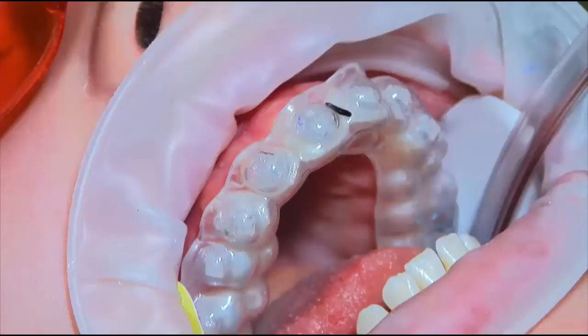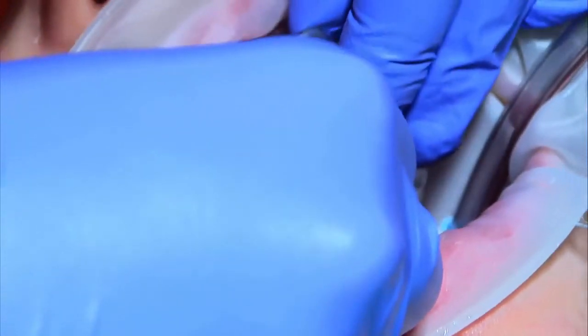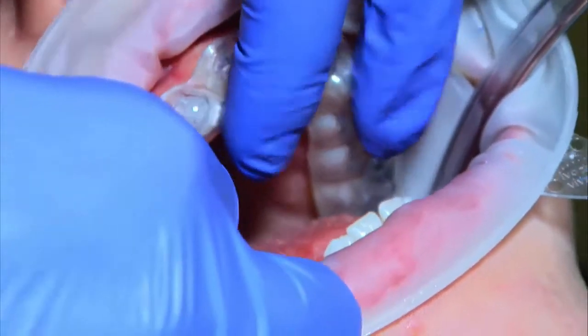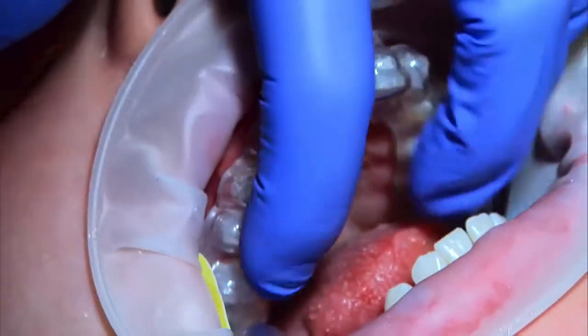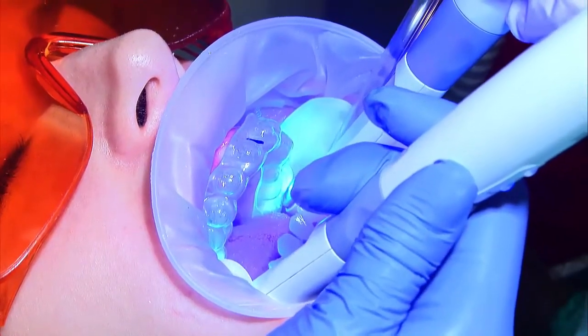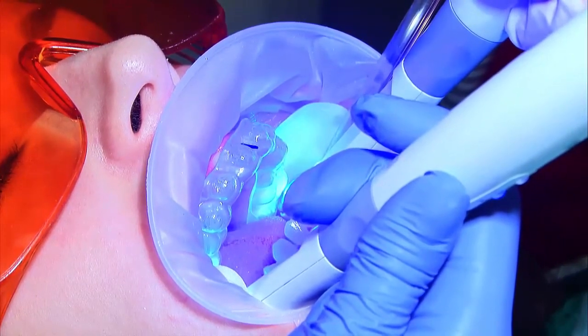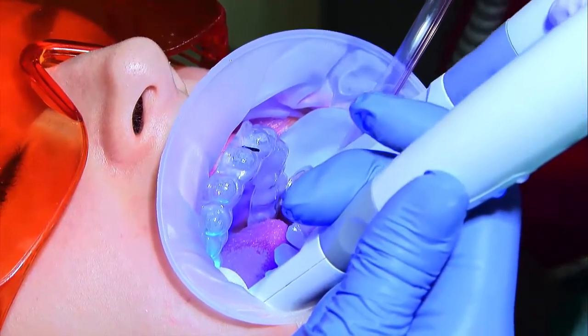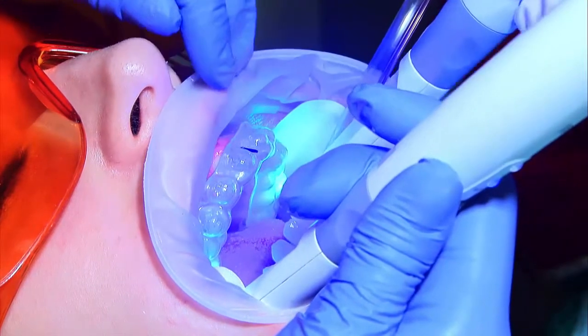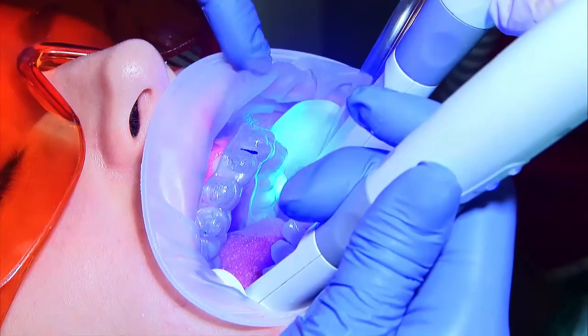Seating is next. On both arches, you will notice the black placement mark at the midline to help with tray orientation. For the upper tray, use a straight-in and straight-up motion. When you feel the tray is seated, use two fingers and push all the way up, applying force only in the occlusal direction. The tray is now ready to be cured. Start with the molars on one side and then move to the molars on the opposite quadrant — at least 10 seconds per tooth at an occlusal angle, then at least 10 seconds more from the buccal aspect.